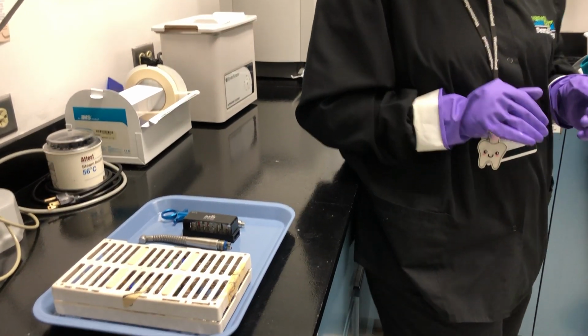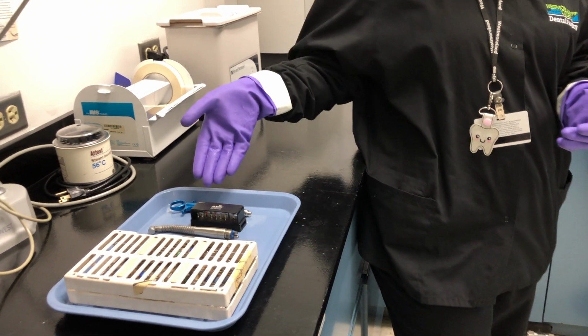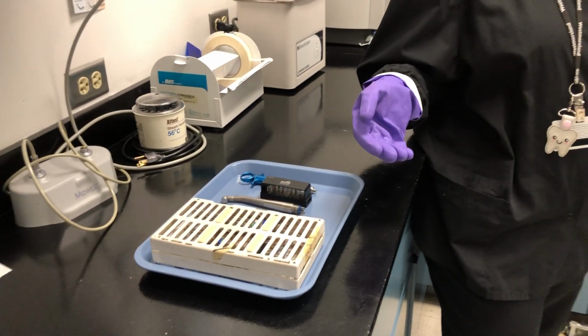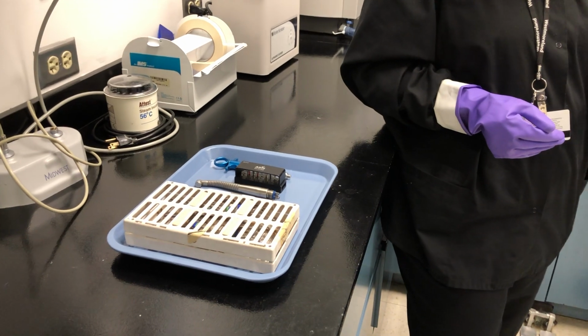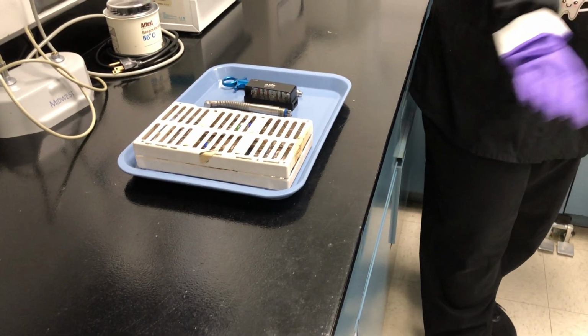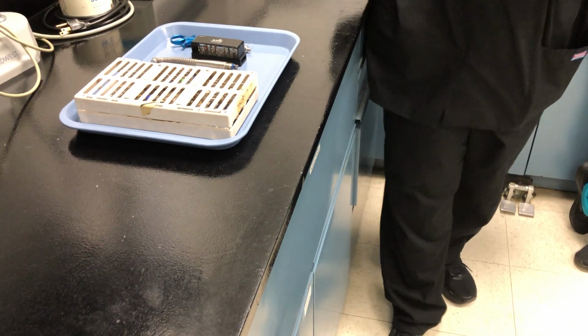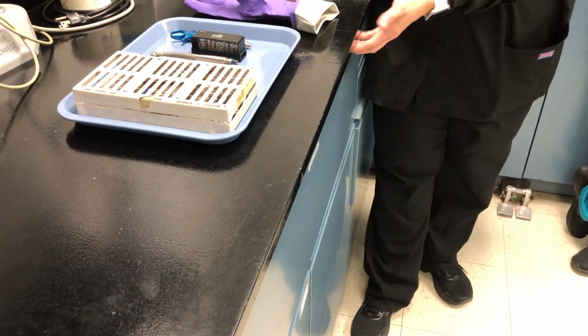So the next thing we would do with these items, it's not actually on your process, but we're going to have you just go ahead and bag them just so you understand what we would do in a normal situation. But all of our disposables and sterilization packaging are in here. So can I just open the drawer and start rustling through the drawer with my purple gloves on? No. Good. So you're going to take one glove off.